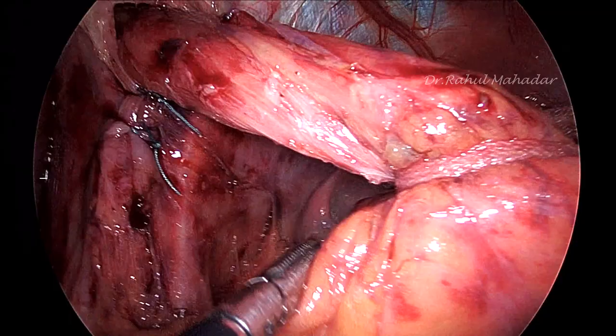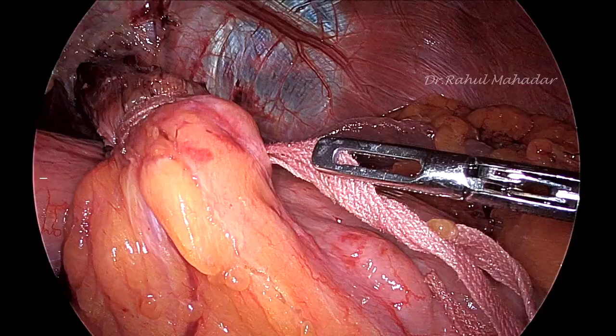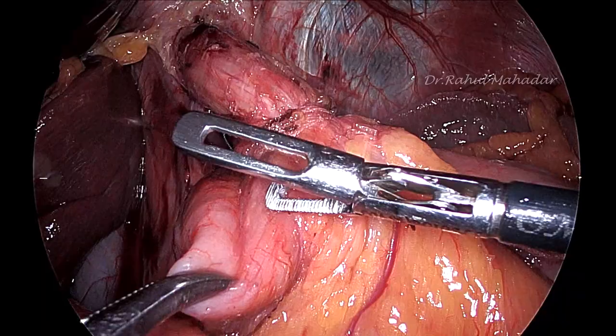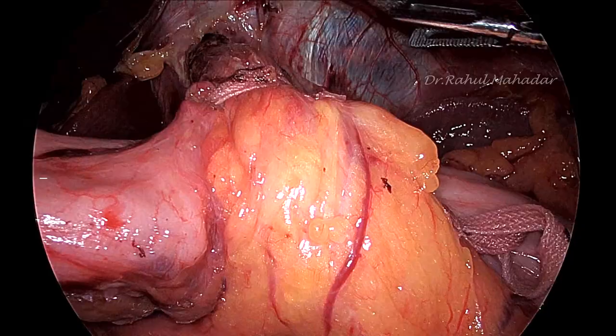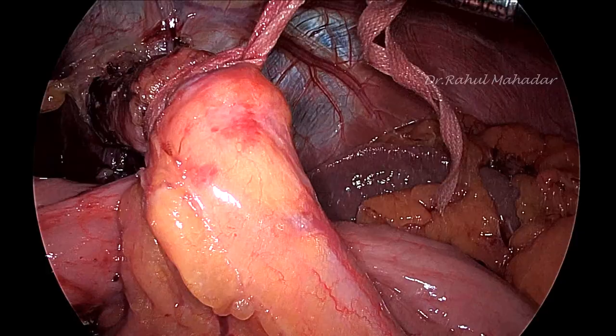and then now here, as the previous manometry is suggestive of a normal motility, we are going to do a Nissen's fundoplication in this patient. So we try to get the wrap around the lower esophagus, ask the assistant to catch hold of the umbilical tape.